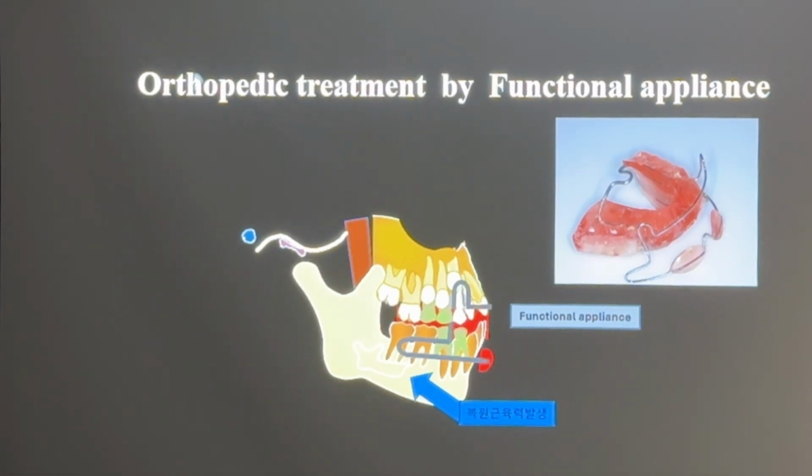So please think about your patient's eruption path. If you want more buccal eruption, at that time grind toward the buccal.